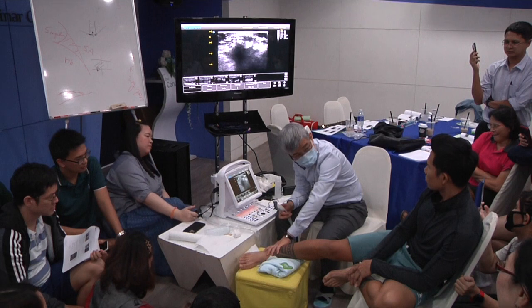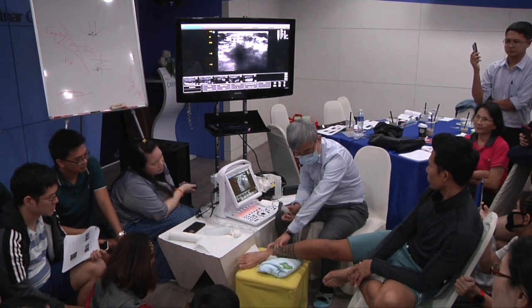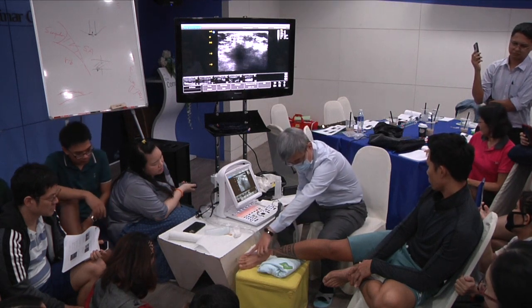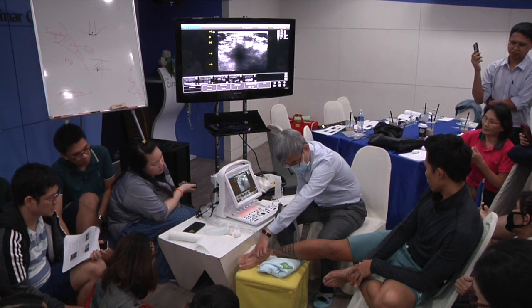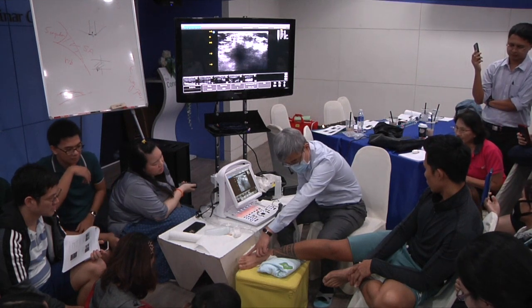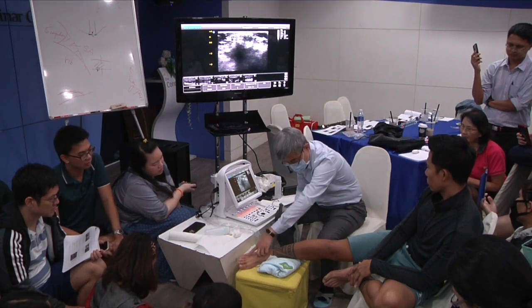In this side lying position. One end of the probe, the other end toward the fifth toe, little toe, fourth, little. Okay.